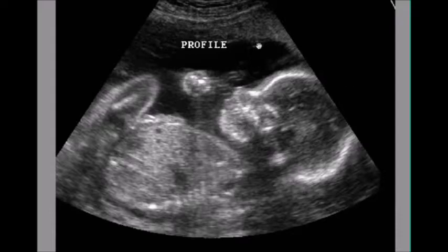Now on the ultrasound, anything that's black, like right over here, is usually air or liquid. So this is liquid. This is the water inside the mother's womb, also known as amniotic fluid. White things are usually bone. So this is the skull of the baby, all the white things. And muscles and other things like that are usually gray in between.